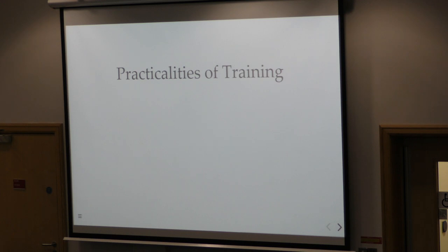And you need to know what layers to put in there, which is not trivial. You can wing that, I think. With our models for segmentation, they turn out to be quite large because we need them to be accurate, and that's probably one of the easiest ways to make them accurate. So this number represents the number of minutes on a CPU it takes one of our models to do inference on a stack of images.